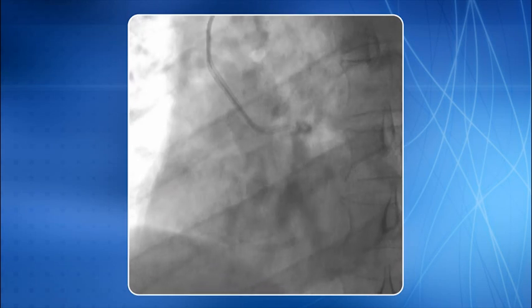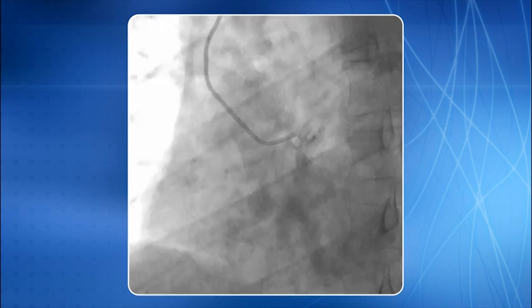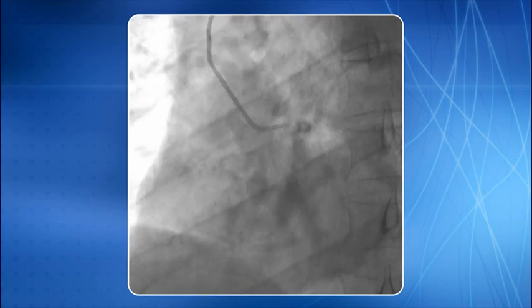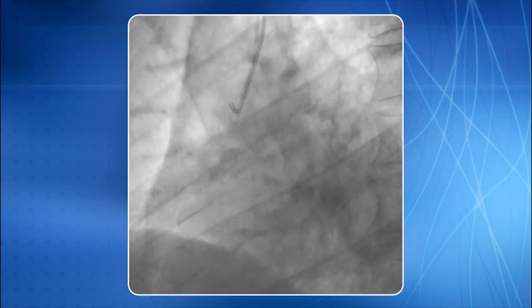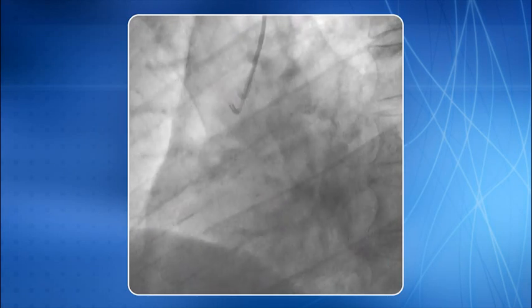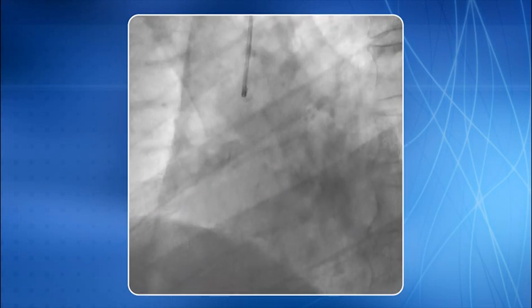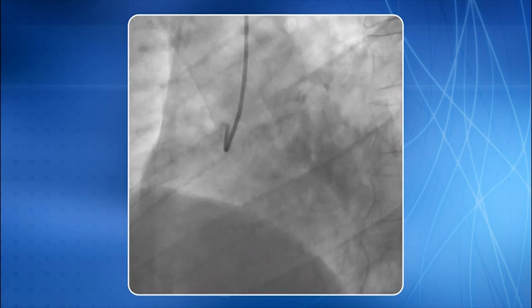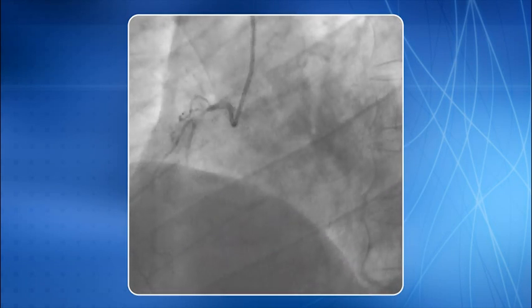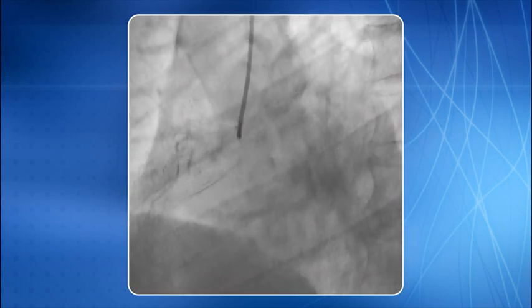Once the left coronary angiogram is done, the catheter is slowly pulled out of the left coronary ostia. It is then pushed towards the aortic valve with a slow and gentle clockwise rotation. A slight pullback of the catheter should usually cannulate the right coronary ostia.